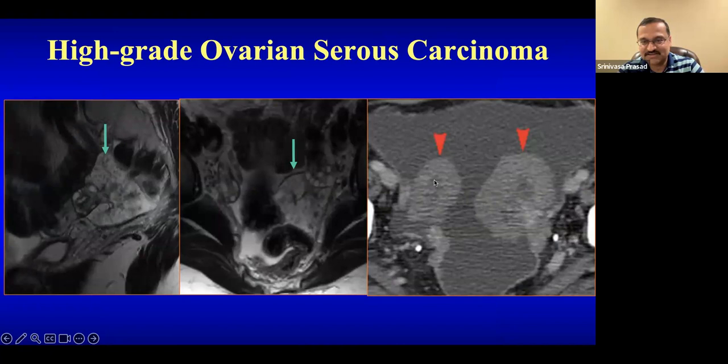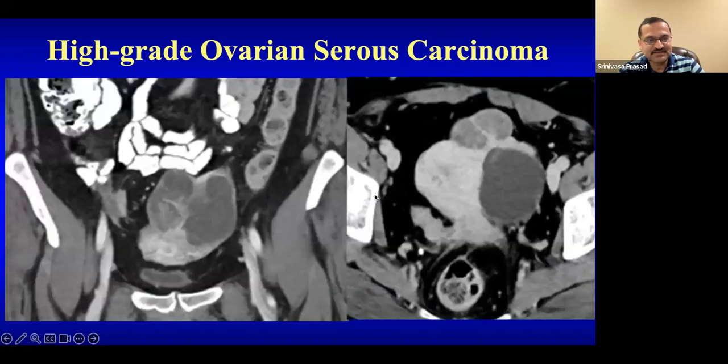And again, another example, we have central so-called normal ovaries that's surrounded by tumor. So high-grade serous cancers typically on the surface of the ovaries. And here are some examples of the so-called high-grade serous cancers with tubal malignancies that we see very clearly on these CT images, that there is hydrosalpinx and enhancing soft tissue within it.